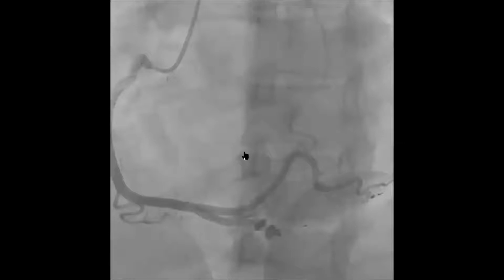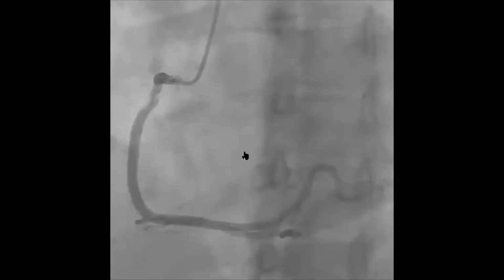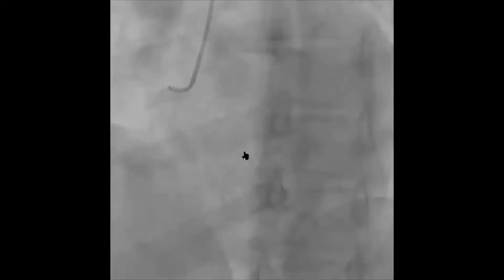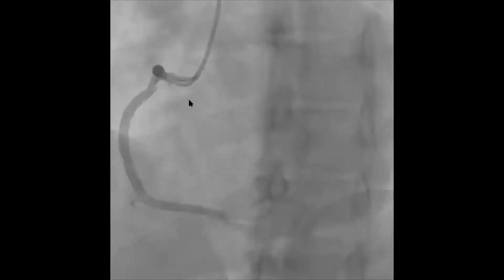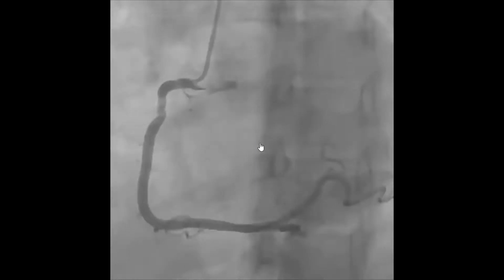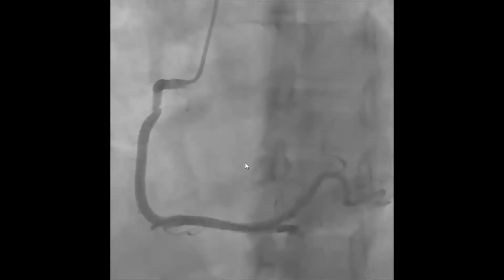Are you seeing any other movement? You'll need to focus on some other movements. You'll see the heart beating, and that is what gives the jerky movement of the artery as the heart continues to beat. So let's just let it play again. So there are the heartbeats. Just focus on that movement for a second. The heart is beating, right?